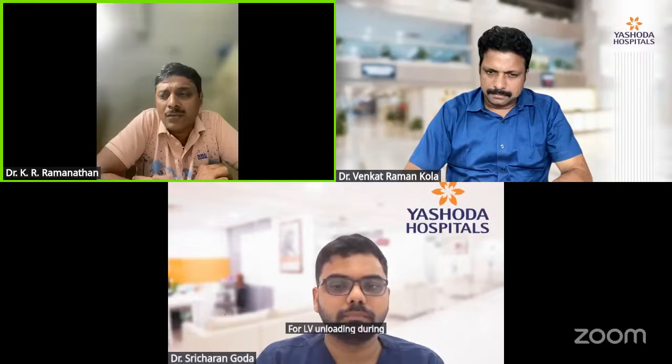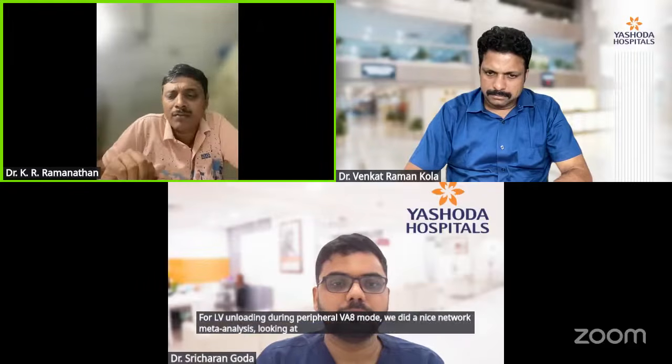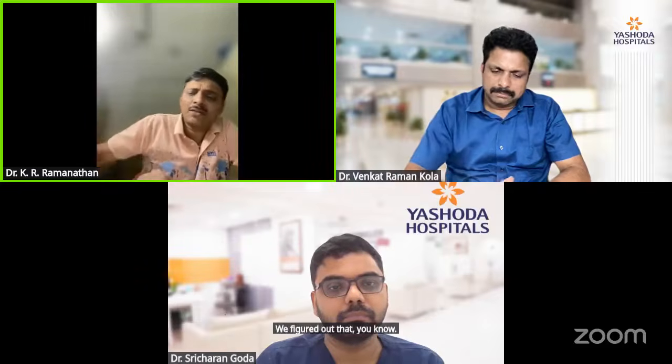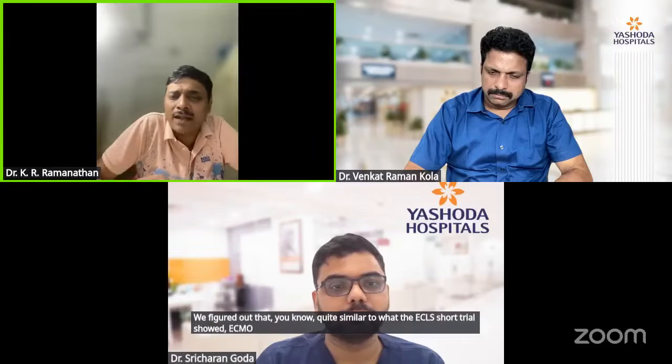If you look at the strategies that have been used for LV unloading during peripheral VA ECMO, we did a nice network meta-analysis looking at about 50,000 patients who had almost all combinations of mechanical cardiac support devices. We figured out that, quite similar to what the ECLS-SHOCK trial showed, ECMO in unison doesn't help the LV.